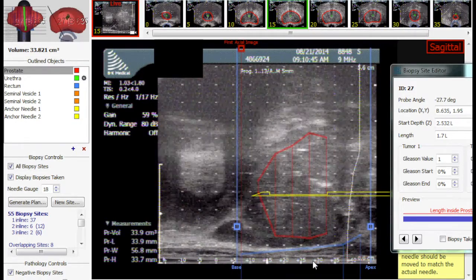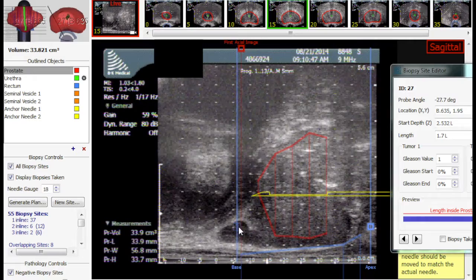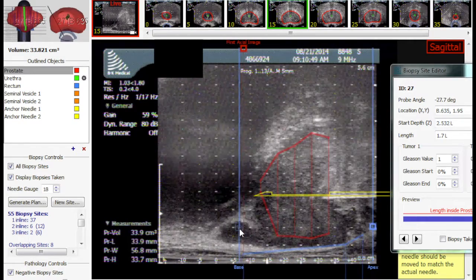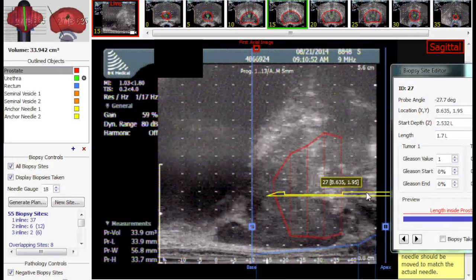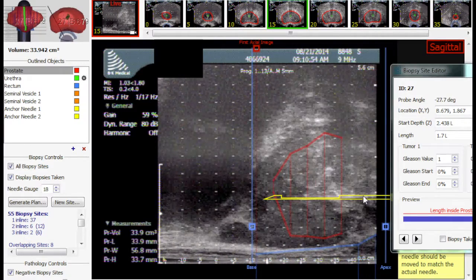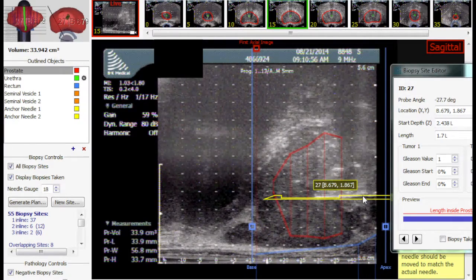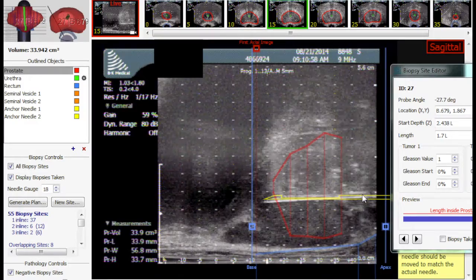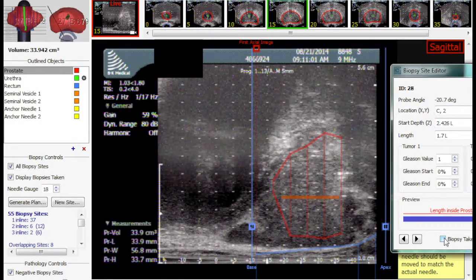The biopsy needle is advanced to the apex. Notice how when the needle is advanced it pushes the prostate towards the head of the patient. This is typical, and the user needs to adjust the base of the contour so it aligns to the base of the prostate before firing the needle.